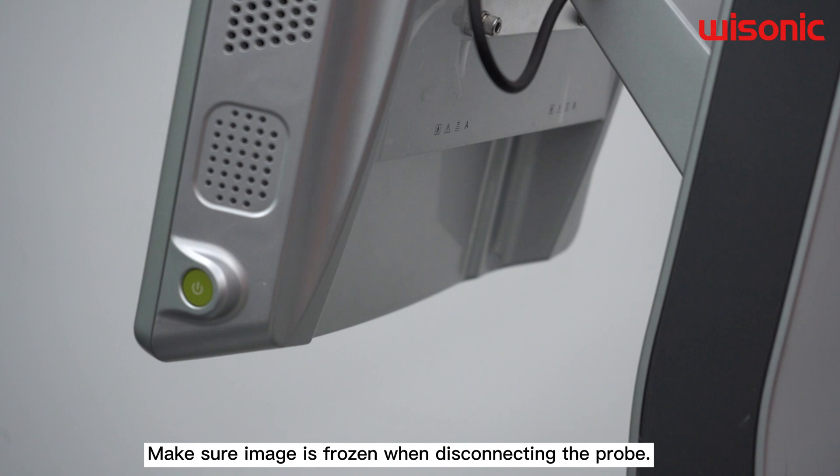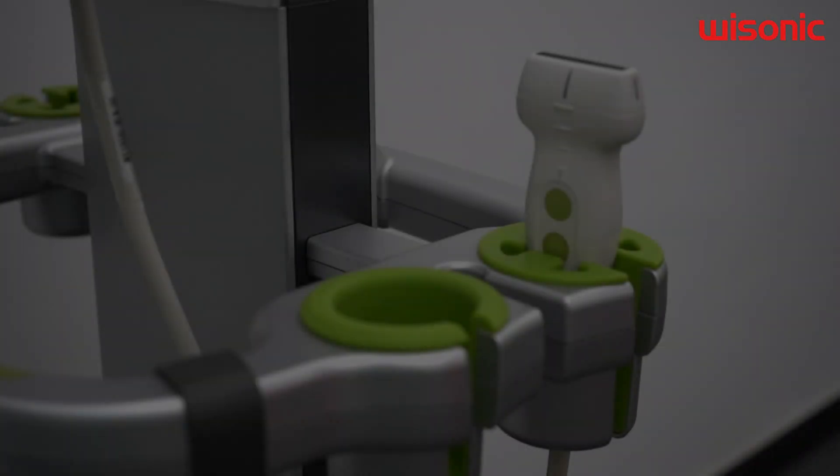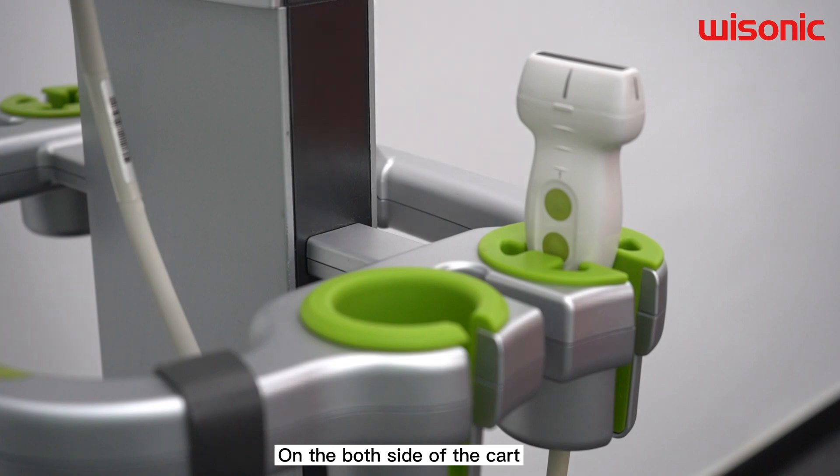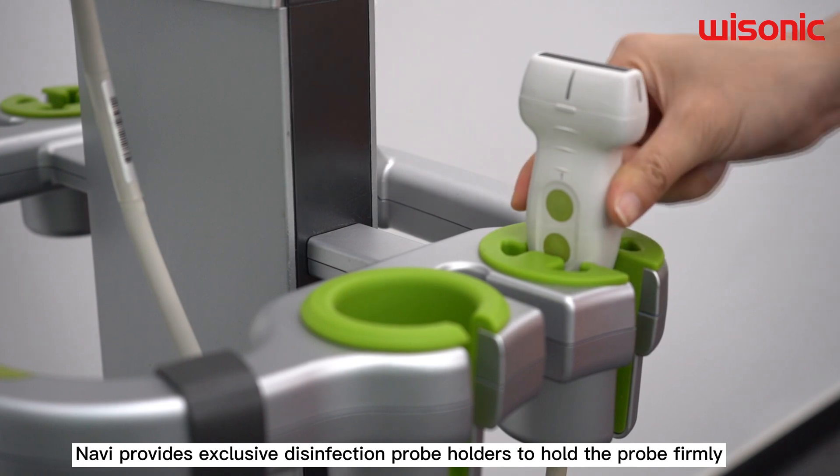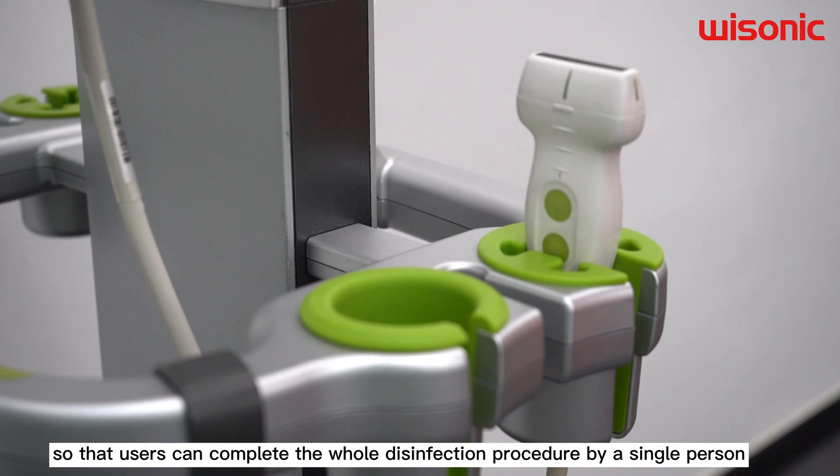Make sure the image is frozen when disconnecting the probe. On both sides of the cart, Navi provides exclusive disinfection probe holders to hold the probe firmly, so that users can complete the whole disinfection procedure by a single person.